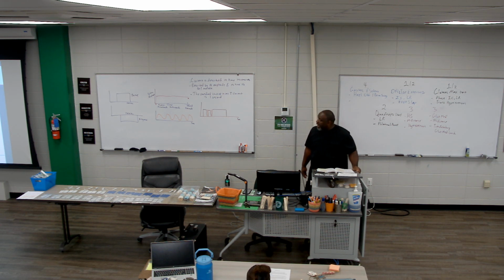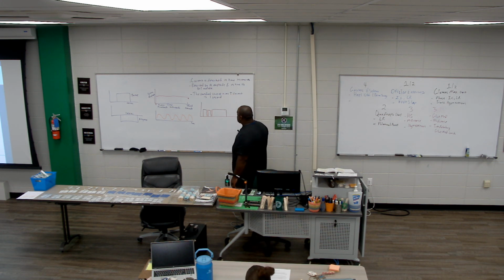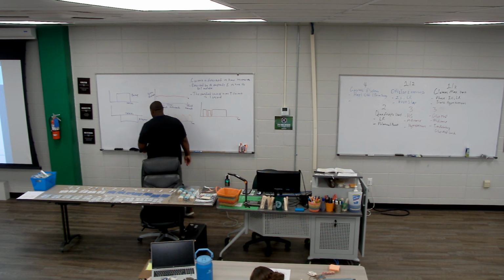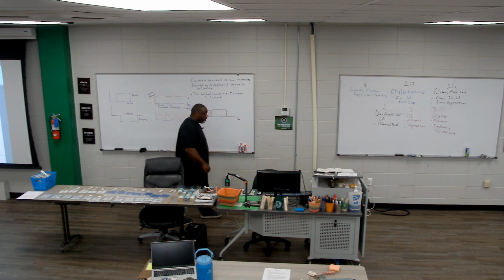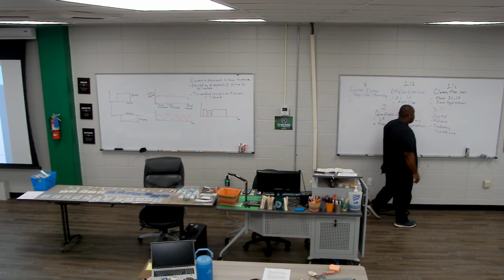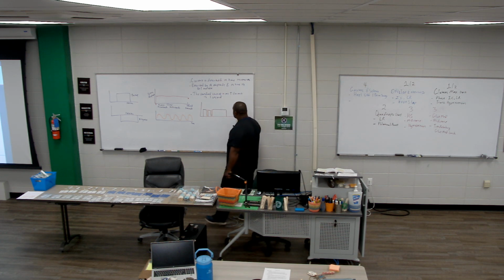So if I'm using AC waveform current types, it's going to be measured in hertz. If I'm using pulsatile current, then I'll use pulses per second to serve as my documentation strategy.